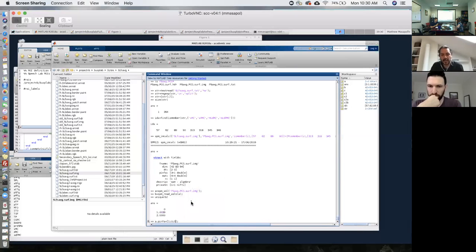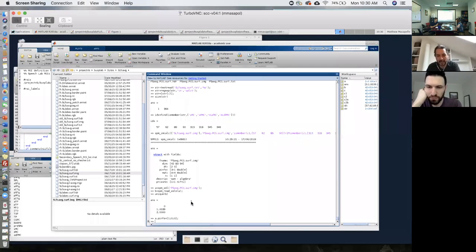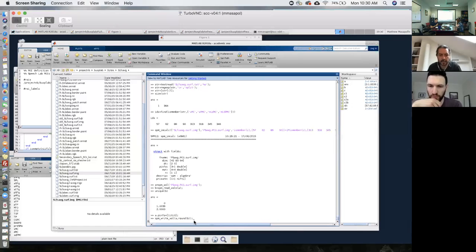Okay, so you enter that AP info 100, this forces, well, I don't want to explain what this does, it's complicated. And then you just rewrite the command, write this other command. And this is rewriting the same file that you just loaded, with the same data that you just loaded, but only rounded, and changing this P info so it doesn't do automatic scaling in SPM, and that's the trick, that's why we add this line. And once you have that, basically that has been fixed. The rounding error issue has been fixed.